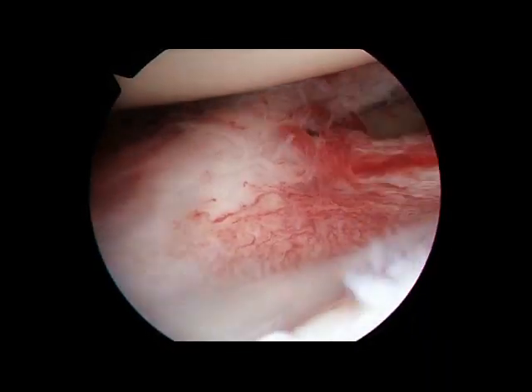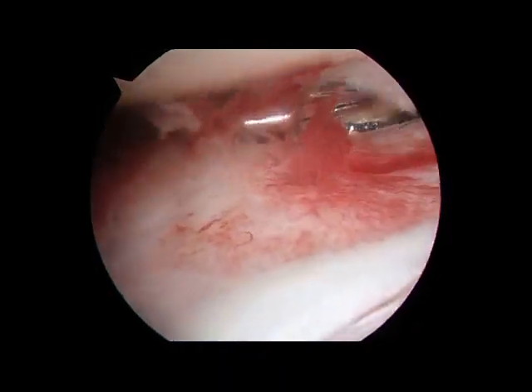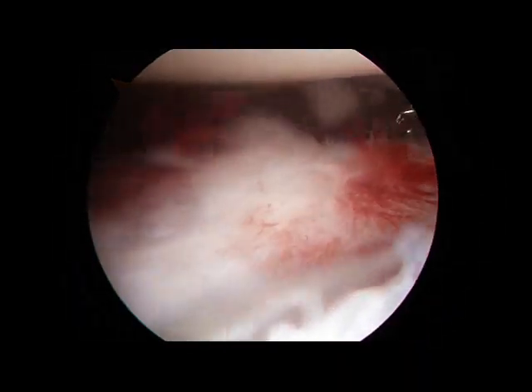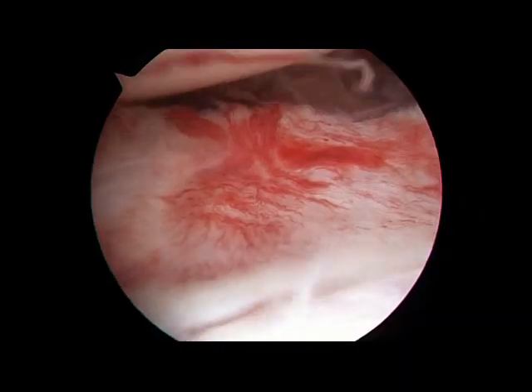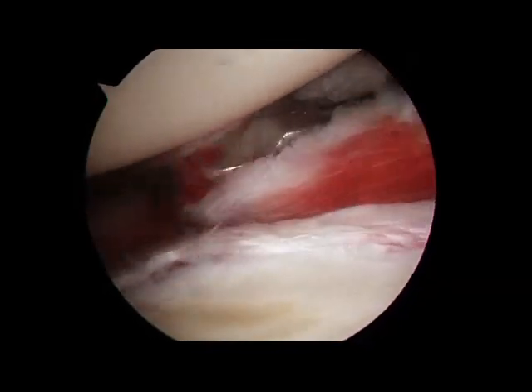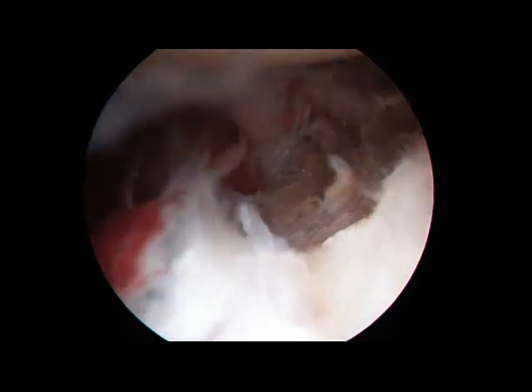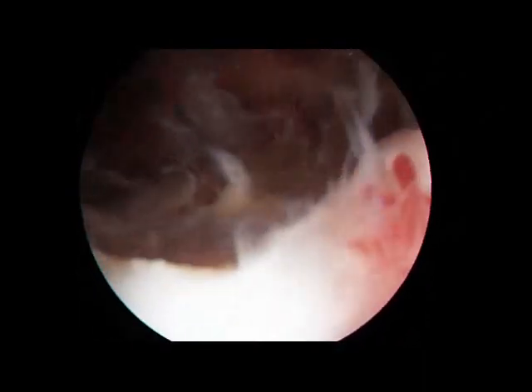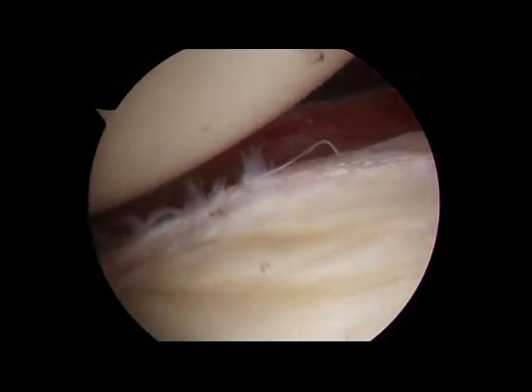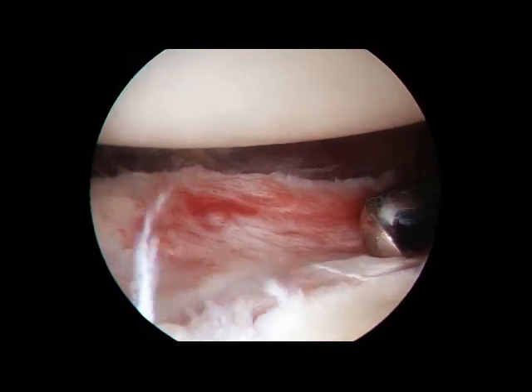From the back of the shoulder, we're just trying to march our way across here and complete this. Looks like we're kind of through now. That looks like we've completed the capsule release. I'm just going to go way down here just to make sure — that looks good. We'll take a step back just a little bit and take the shaver. Look a little bit more to the right — you can see we're all the way through.